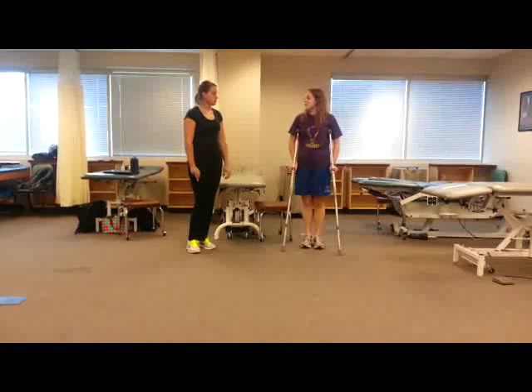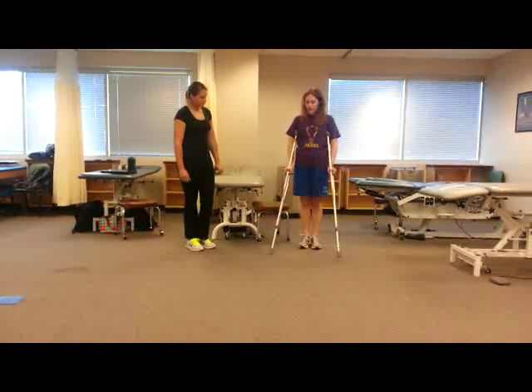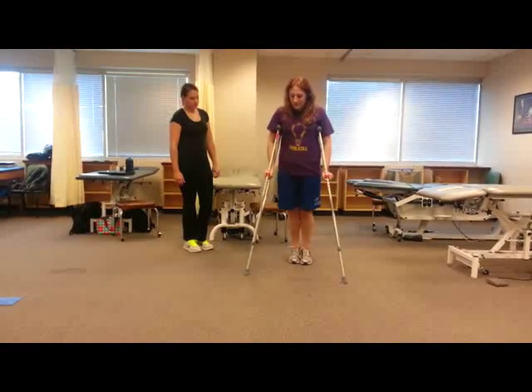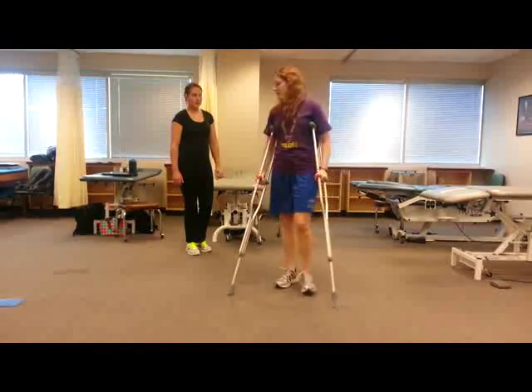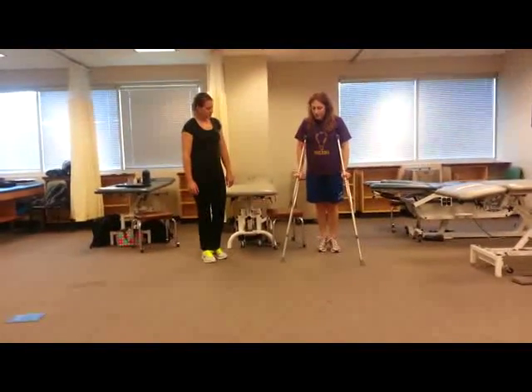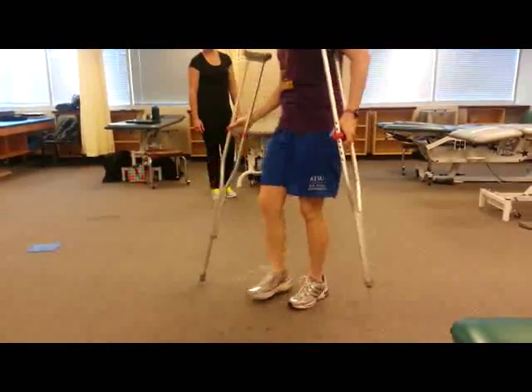The last two are kind of similar. There's one called a swing-to — that's where we move both legs together but we just go right to the crutches. The patient might need to lean back just a little to get that momentum. They do the crutches and then their legs. Like the four-point, this is a slower gait. If they're good at that, feel comfortable, and are stable enough, then they can do a swing-through, which is the same movement — crutches and both legs — but they go all the way through the crutches so they can cover more ground in one step.